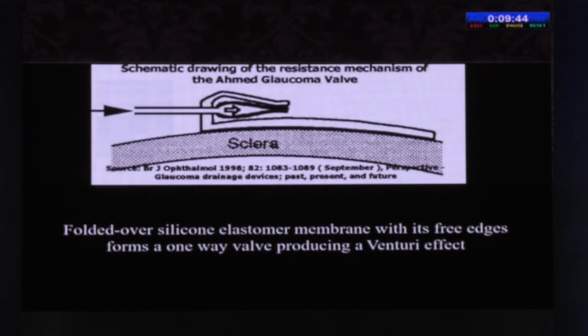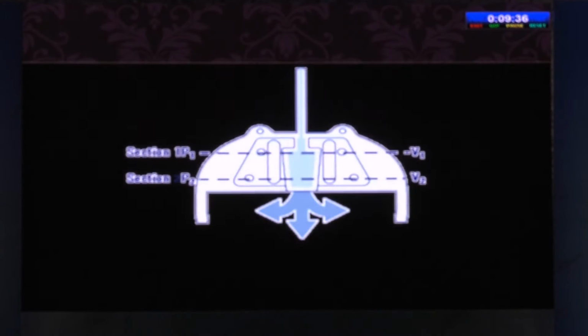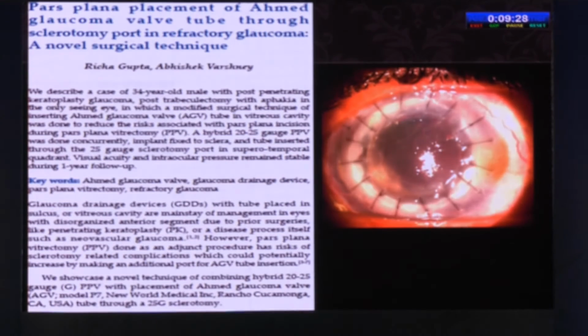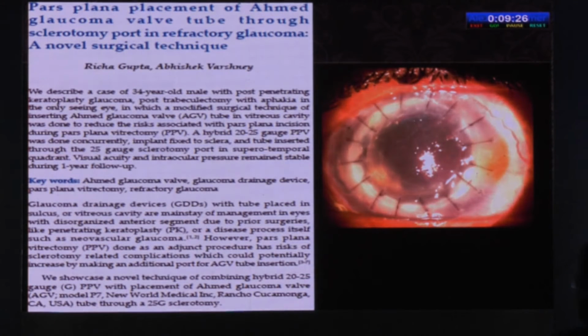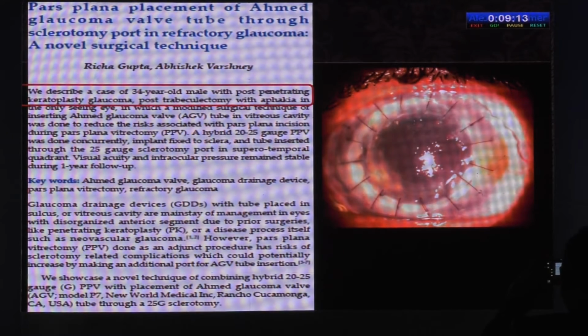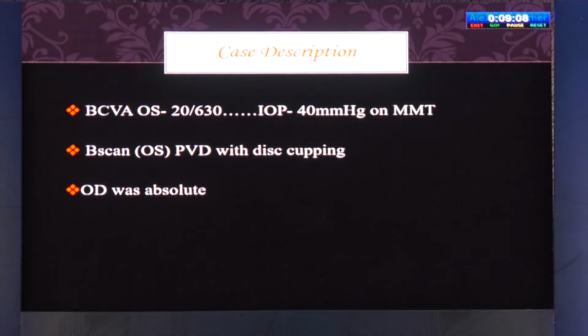So how does it work? This is the trapezoidal frame of the valve, and the increased exit velocity helps to evacuate the fluid with minimal valve friction. I have this case which was published recently, a case of a 34-year-old male who had undergone a penetrating keratoplasty, had already undergone trabeculectomy and cataract surgery, and he was one-eyed. The BCVA was 2/60 and the intraocular pressure was 40 on maximum therapy.